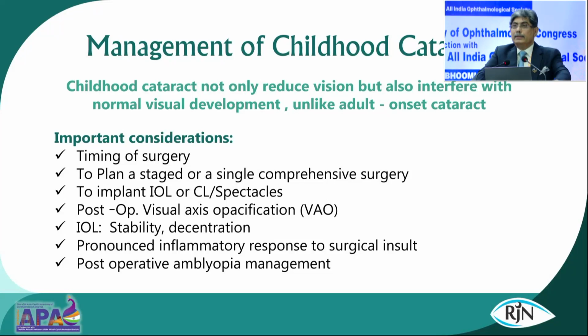So important considerations are the timing of the surgery, whether we have to do the surgery or not, what type of surgery, whether a lens has to be implanted, and whether to plan a staged or a single comprehensive surgery to implant an IOL, or we can rehabilitate by contact lens or spectacles. Post-op visual axis opacification is another important aspect.